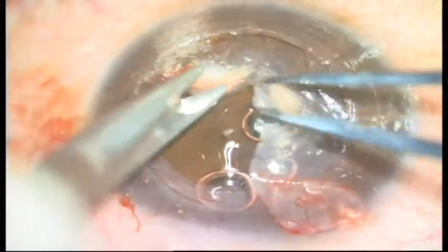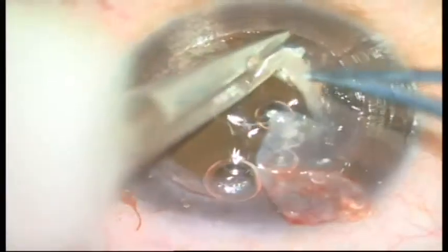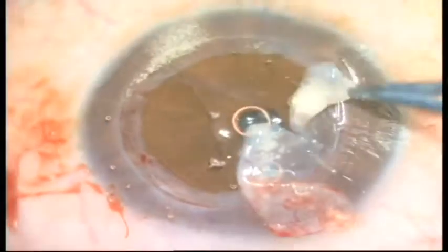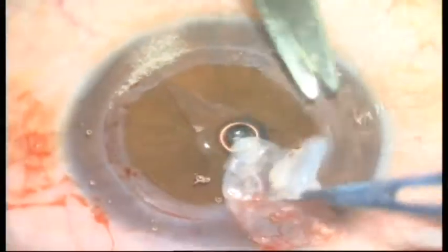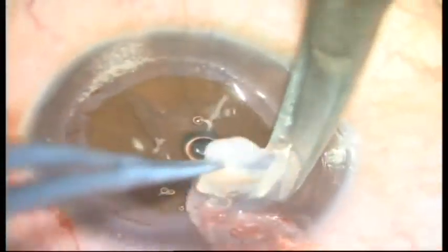to reform the pressure of the eye, removal of the rest of the stroma from the endothelium in the other quadrants, leaving the area where the perforation happened, facilitating the removal of the stroma from the endothelium, taking care not to cut the Descemet membrane and the endothelium at this area. And the last part to be removed is the area where the perforation had happened.